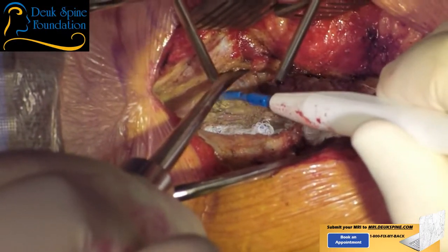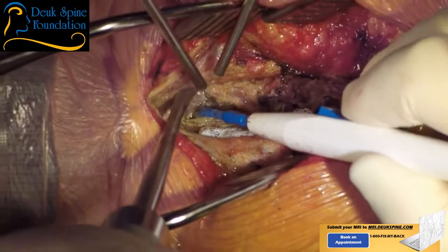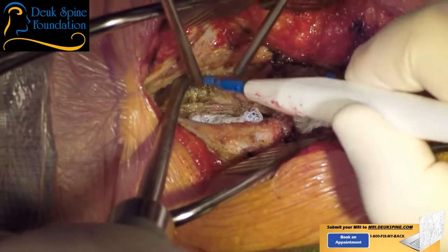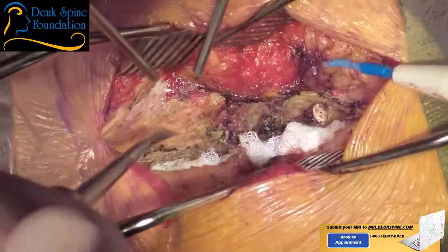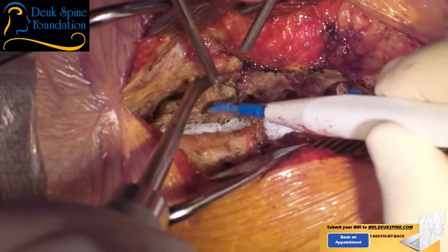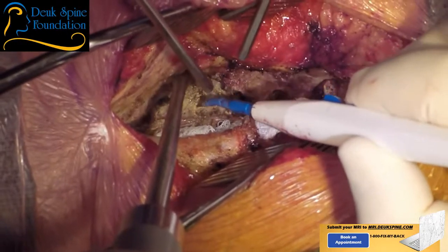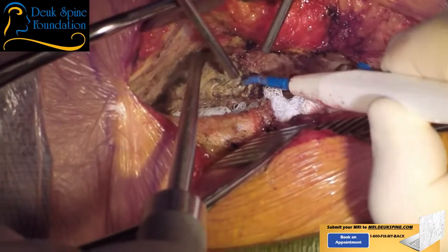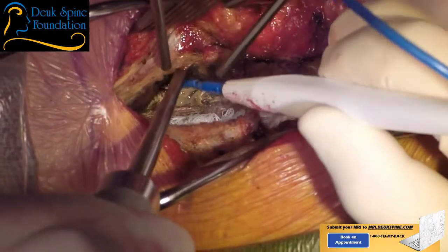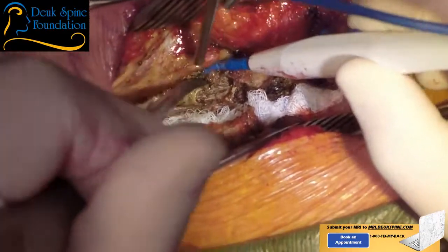So I'm right on the tip of the spinous process here. I don't know which one it is. I just know that it's still a spinous process, and we're going to expose pretty much all the spinous processes here in the upper cervical and mid-cervical spine, even the lower cervical down to C7 and down into the thoracic, T1 and T2. So that's all I'm doing right now is peeling the muscle off of the spinous processes. And the way I'm doing it is a technique called subperiosteal dissection. I'm basically using my bovi and my retractor to gently retract and then cauterize. It's actually using plasma to cauterize the tissue. And it uses heat. So we're basically, it's like a barbecue moving through here.